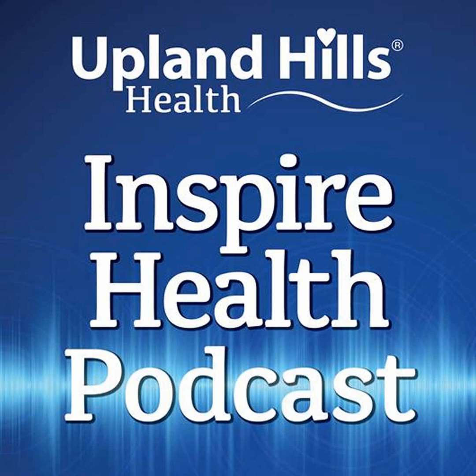Now, what do you recommend if I get the flu or I have a cold? What happens to all that virus and bacteria? Should I stop using my machine? There are filters on the back of the machine. It's important to have a clean atmosphere in general for your health. But when you have the CPAP on, typically people have humidity with it or they have heated humidity with it.